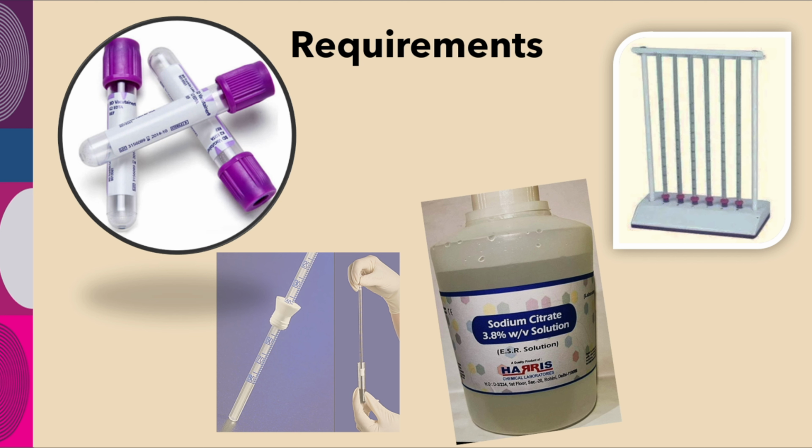Requirements are very simple. We need some tubes with anticoagulant so that blood will not coagulate, and this is the ESR stand with tubes, and this is sodium citrate solution, and these are Westergren tubes. We will further discuss the requirements, but this is the basic requirement for the ESR practical.